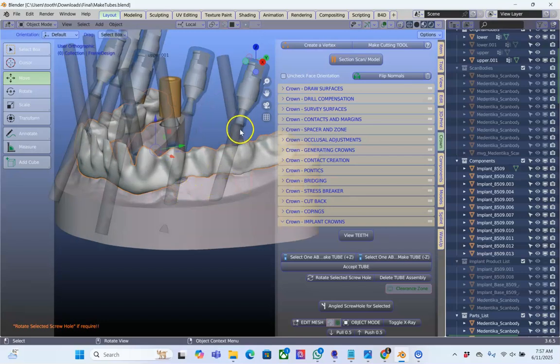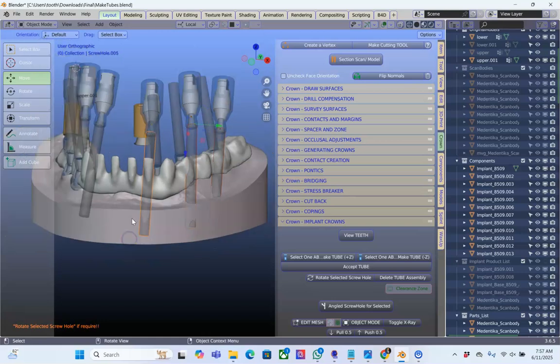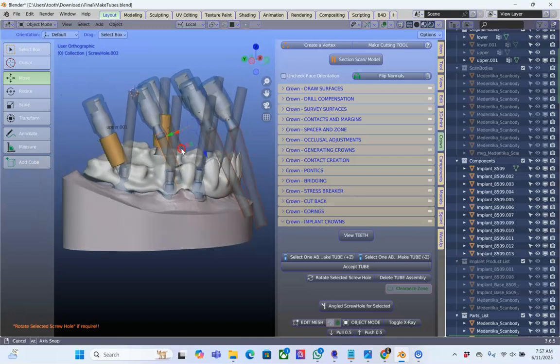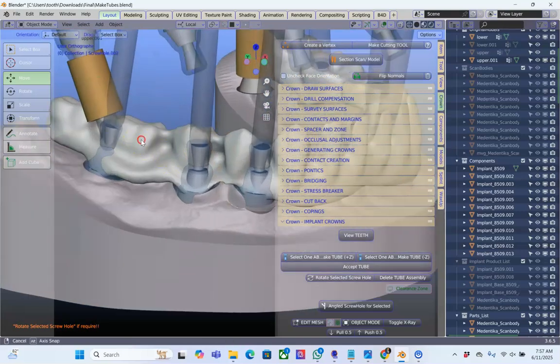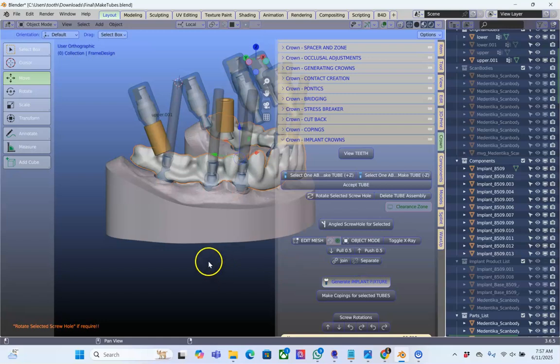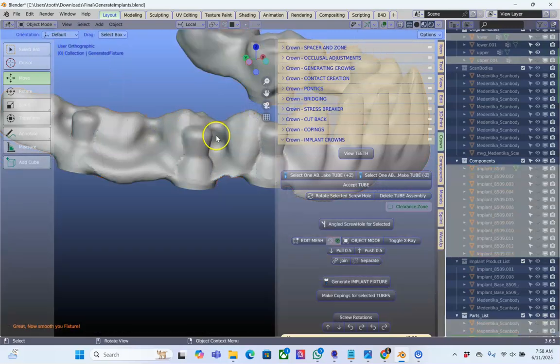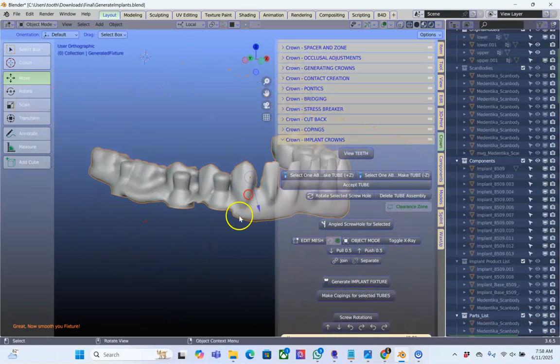But before I do that, just to be safe, I'll just hide the top ones from view here, so that it doesn't confuse the system. Hide, and there's another one over here. Okay, so now I'm going to take this and generate the implant fixture. Okay, you can also see how this is bulged out. This is looking really, really good. Of course, now I'll just smooth this down a little bit.